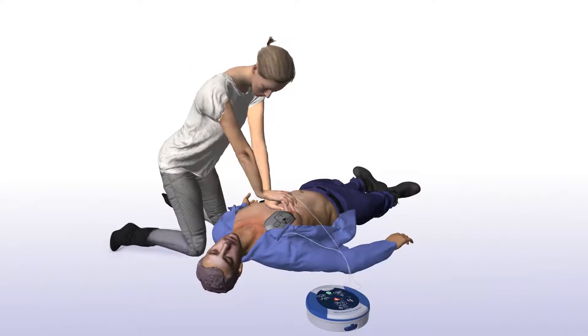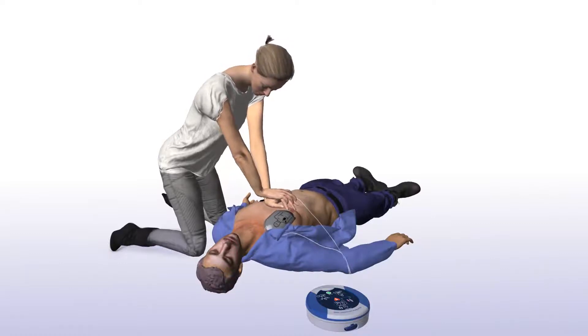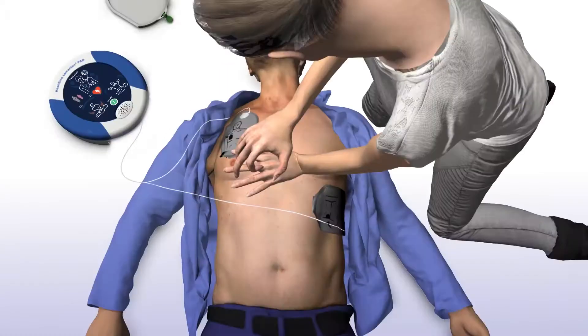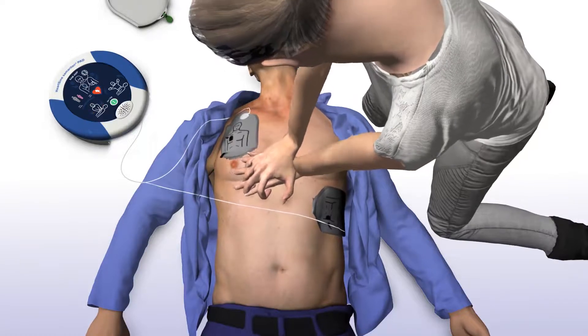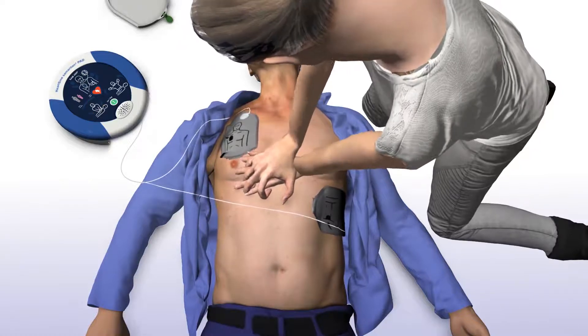The SAM 450P will tell you how and where to place your hands, as well as provide real-time audio-visual feedback on the rate of your chest compressions. The device instructs: "Place overlapping hands in middle of chest. Press directly down on the chest in time with metronome."